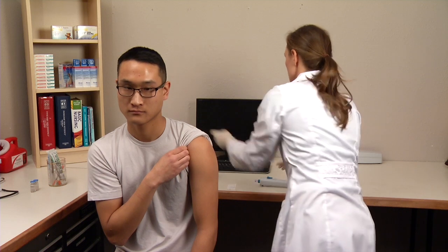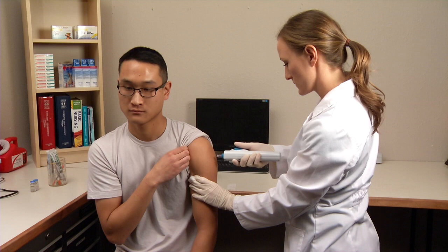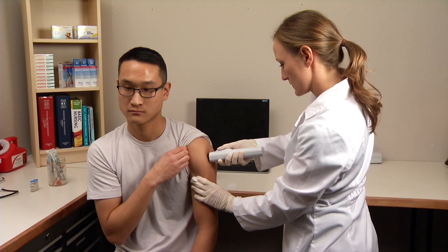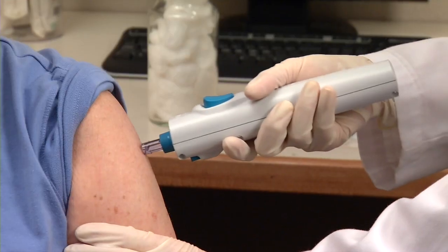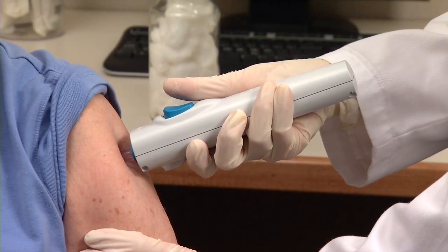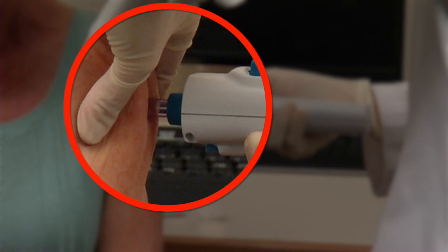For an intramuscular injection on an average size arm, push straight into the most muscular section of the deltoid muscle at a 90-degree angle, assuring proper intramuscular delivery. An arm with more adipose tissue may require increased pressure to adequately place the injection into the muscle. In an arm with little to no adipose or muscle tissue, you should bunch up the muscle to limit the depth of fluid penetration.